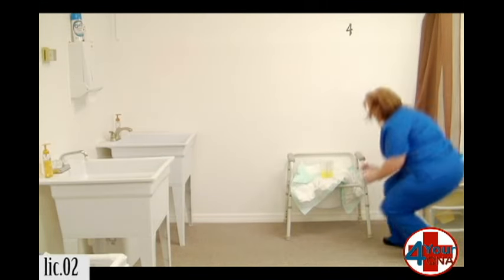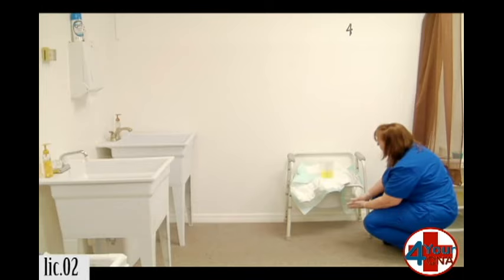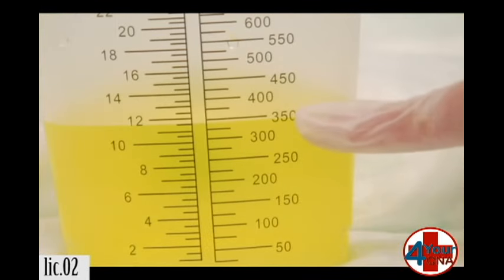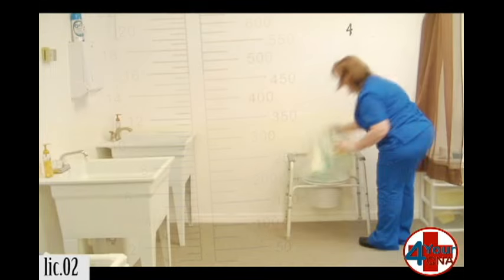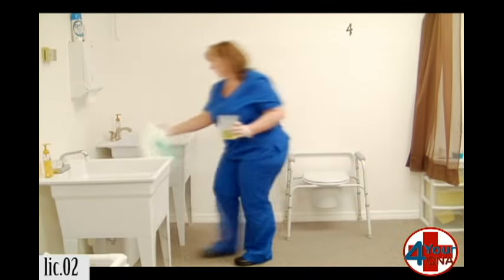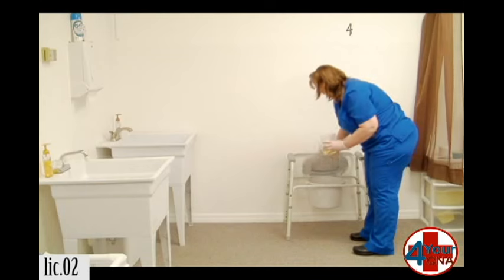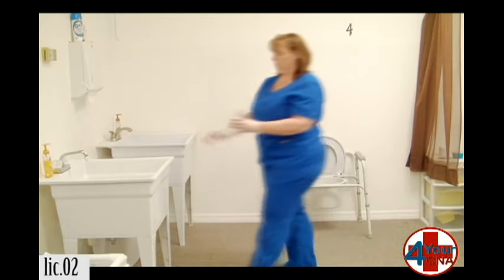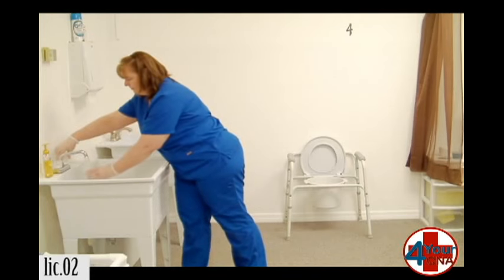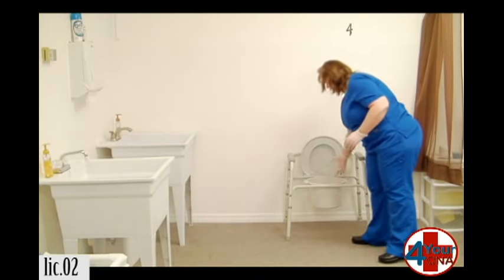I'm going to get down at eye level to measure this. You're going to round to the nearest line. And as I can see, that's 350. This will get thrown away, and we're going to put the urine in the toilet. Rinse it out, and we'll put the rinse water in the toilet as well.